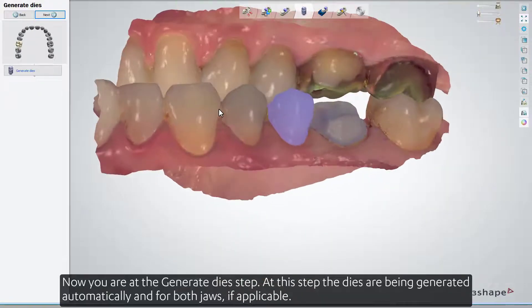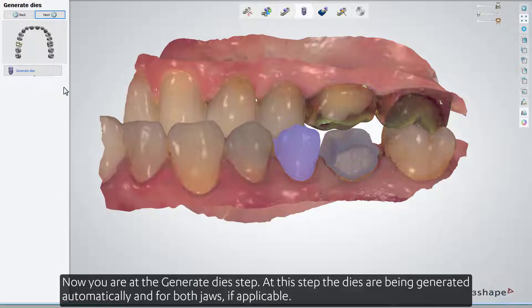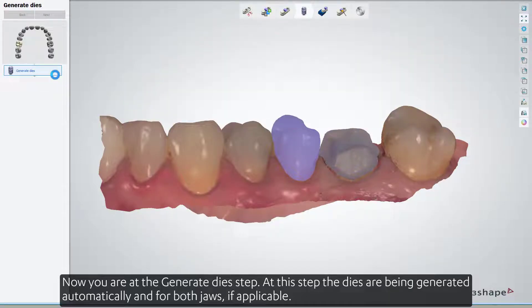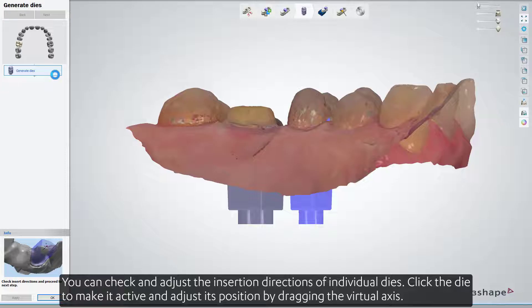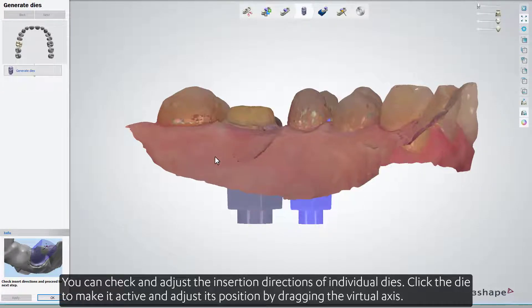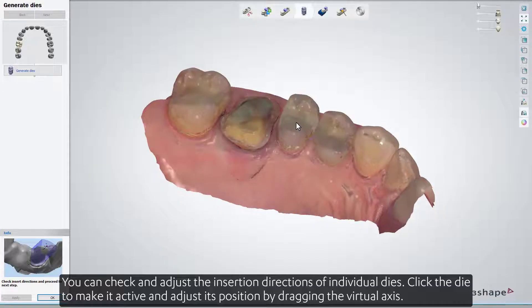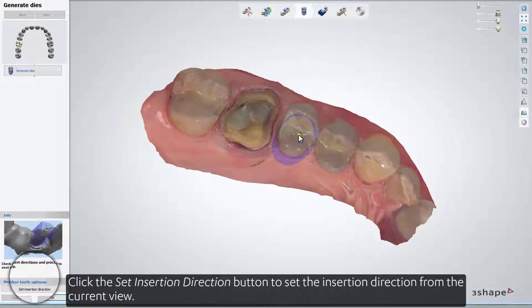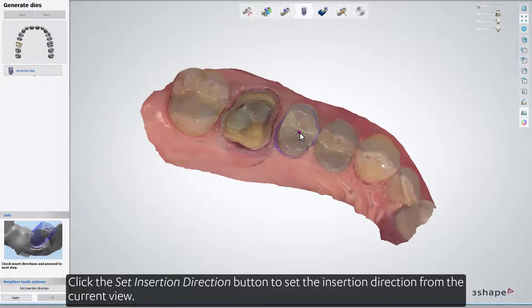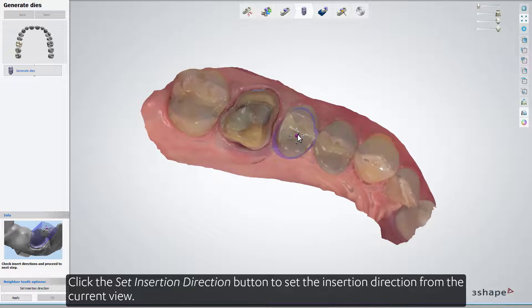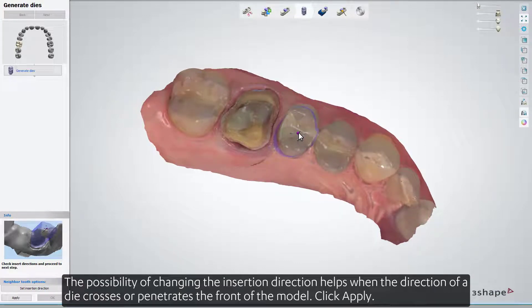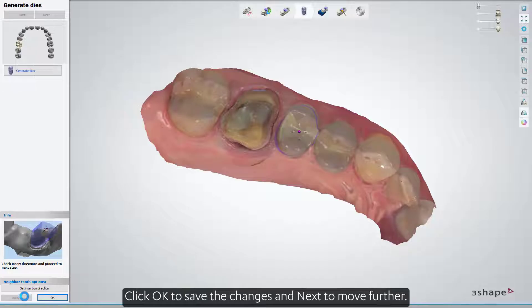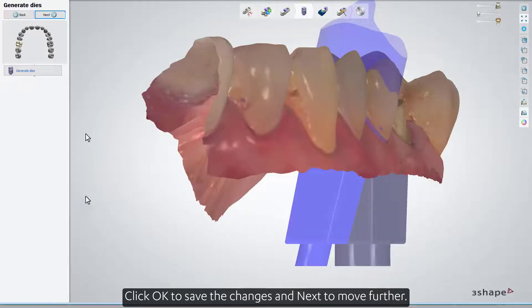Now you are at the Generate Die step. At this step, the dies are generated automatically for both jaws, if applicable. You can check and adjust the insertion directions of the individual dies. Click the die to make it active and adjust its position by dragging the virtual axis. Click the Set Insertion Direction button to set the insertion direction from the current view. This helps when the direction of a die crosses or penetrates the front of the model. Click Apply, then click OK to save the changes, and Next to move further.